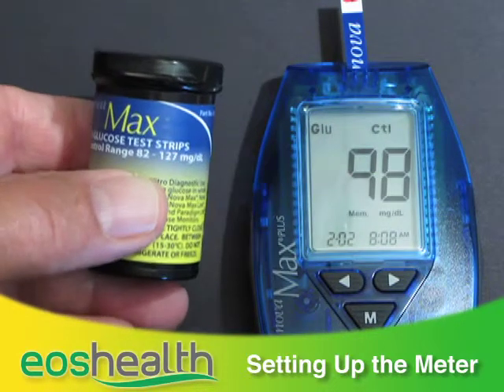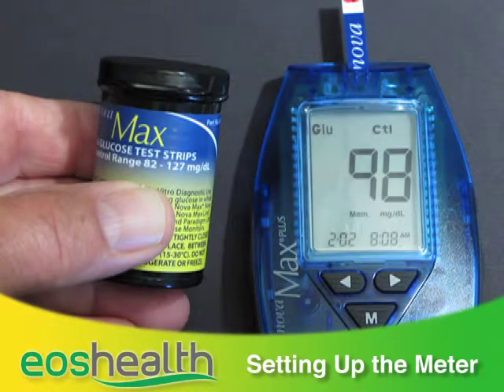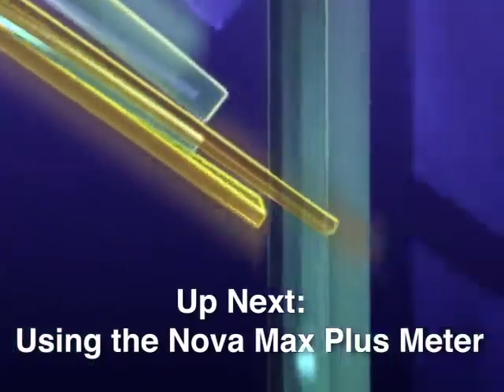Compare the result on the display with the range printed on the test strip vial. If the results fall within the range, your monitor and test strips are working correctly. Up next, we'll go over using the Nova Max Plus meter.